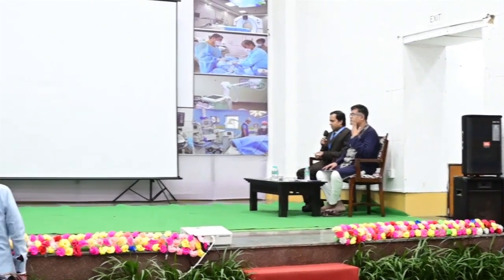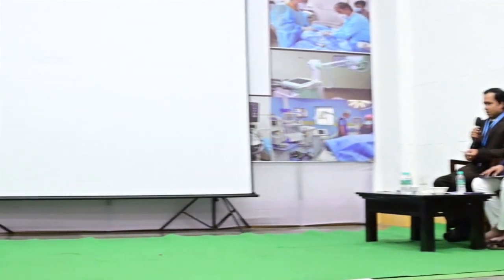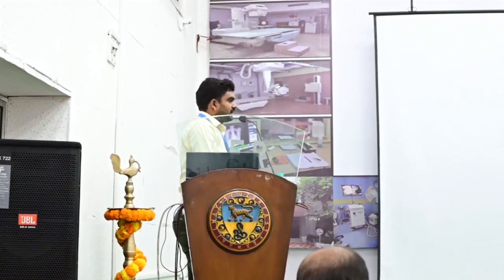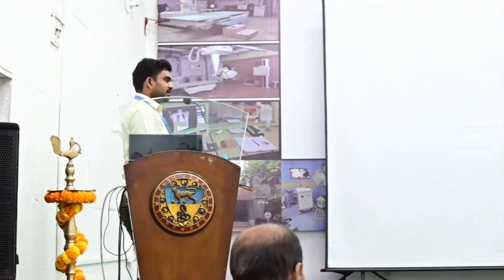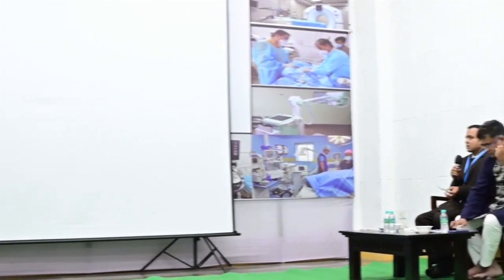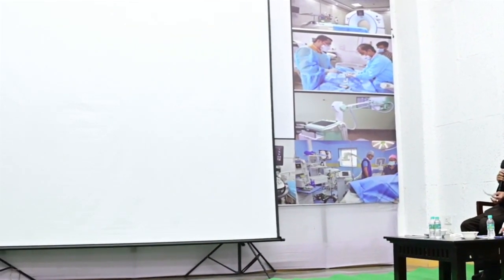What is the input phosphor of the image intensifier? What have you said? Cesium iodide. Yes, sir. Or another phosphor. What is the benefit of putting cesium iodide in the input phosphor rather than another phosphor? Cesium iodide is more sensitive, sir. More sensitive means it will react with low radiation.